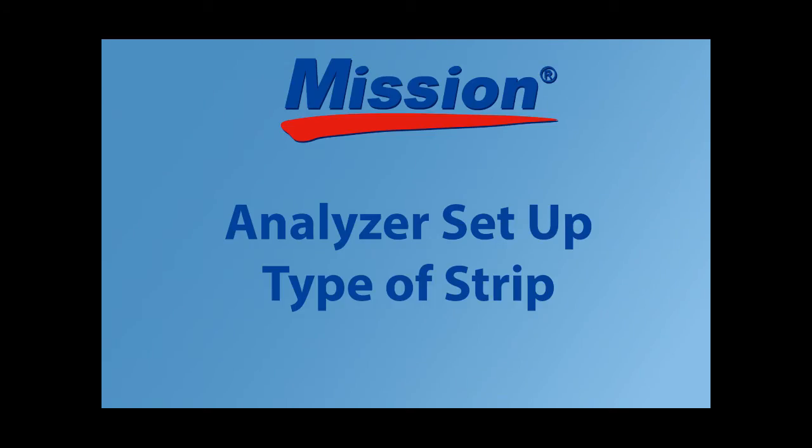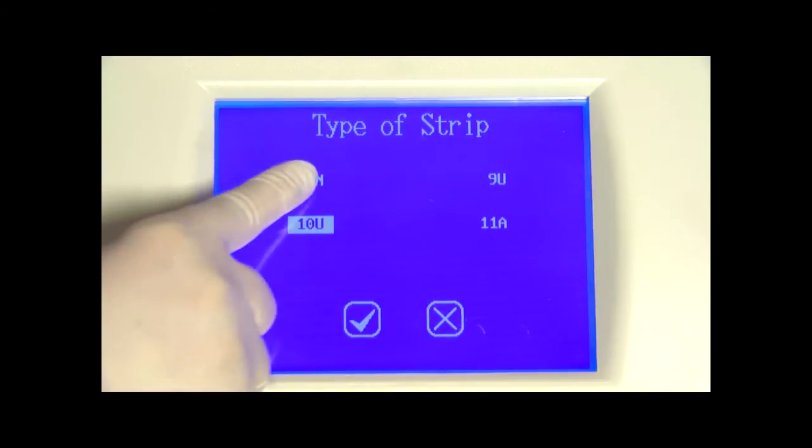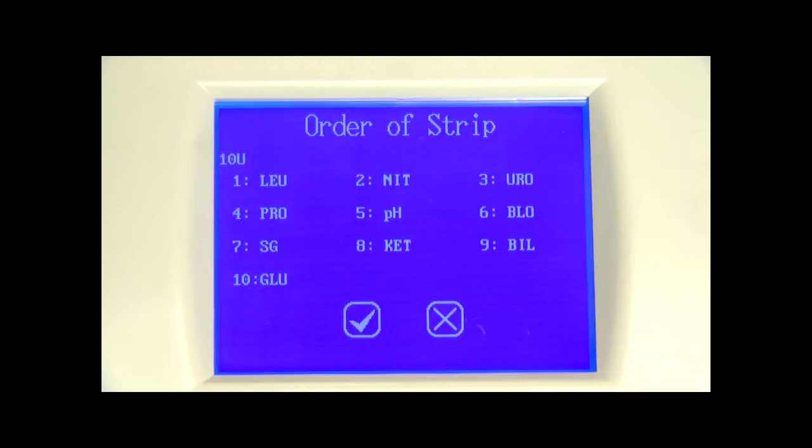From the main menu, press the type of strip icon to change the strip type — the currently selected type will be highlighted. Each strip type name defines the number of test parameters per strip. Make sure that the type of strip selected corresponds with the strip to be used; if not, an error message will be displayed. Select the type of strip to be used for testing, and press check mark to enter the order of strip screen. If user login is enabled and operator ID is 11 through 20, the operator can only view settings. The order of strip screen is used to select the order in which parameters are displayed on the results screen and on printouts.